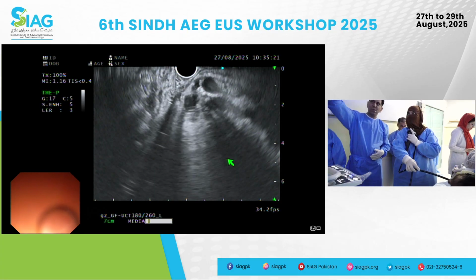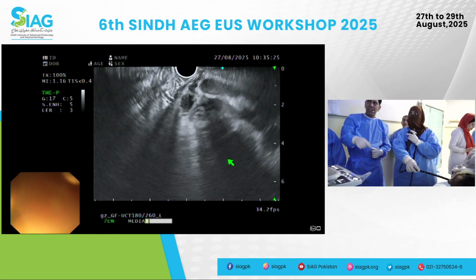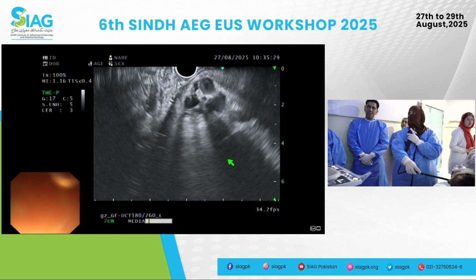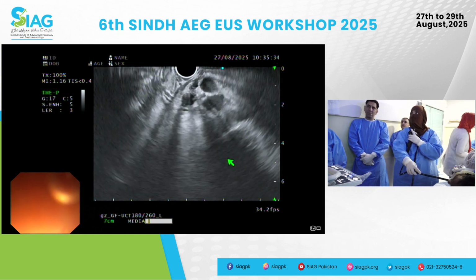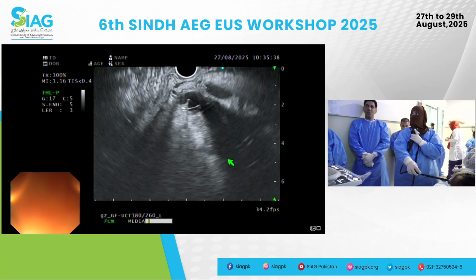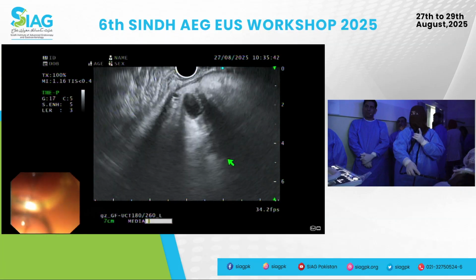Why is there resistance? Why are we actually getting some mucosa hung up against the tip of the scope? Maybe a hiatus hernia? No, but we didn't see anything. We didn't appreciate anything, did we? Okay, because the big bubble is too much. Yeah. That's the reason, okay.